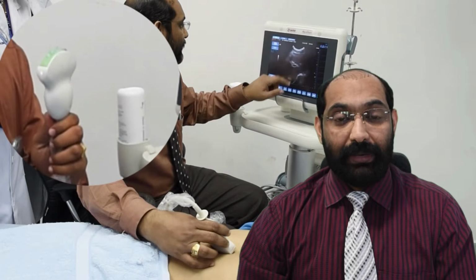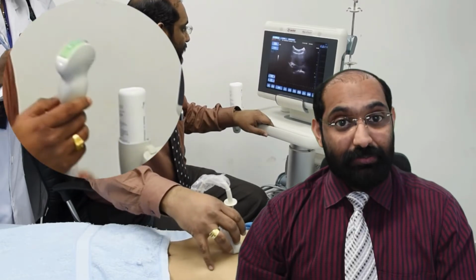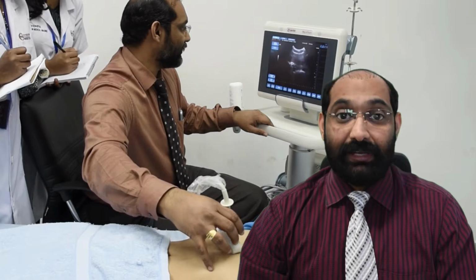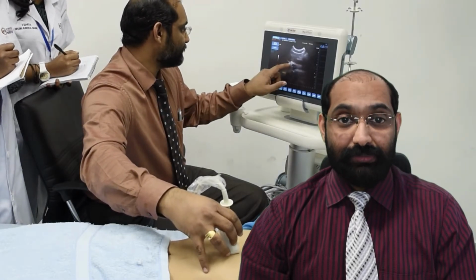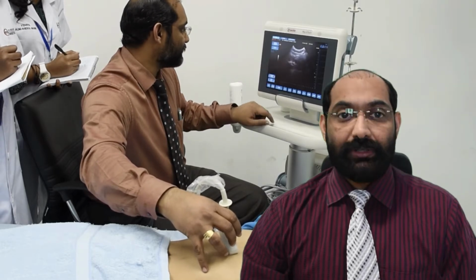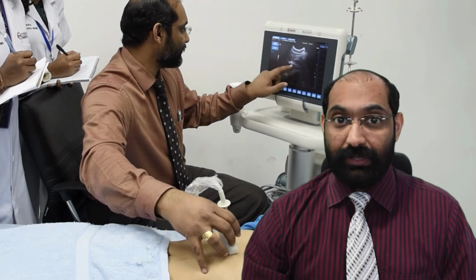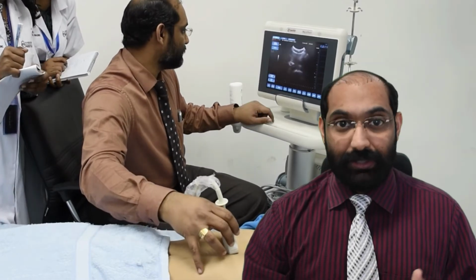I would like to give a short explanation of medical ultrasound systems. The main component of a medical ultrasound system is a transducer, which is made up of an array of piezoelectric crystals. An electric supply is delivered to these piezoelectric crystals. It vibrates and produces high-frequency sound waves, which is known as ultrasound. So the transducer sends ultrasound waves to the human body, and this ultrasound will be penetrating through the internal organs.